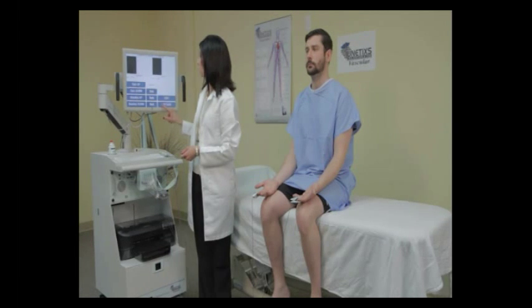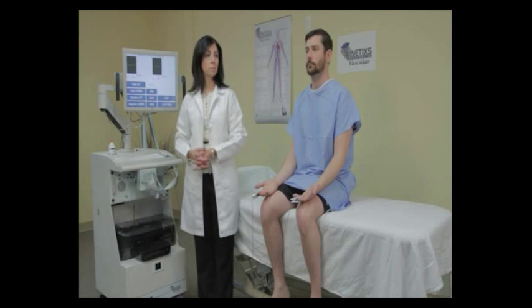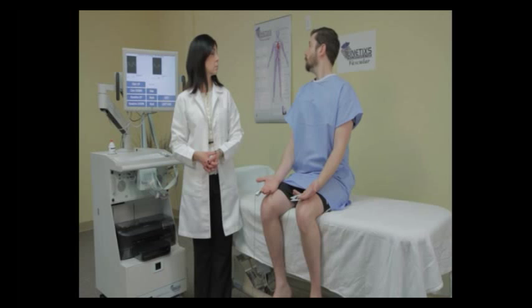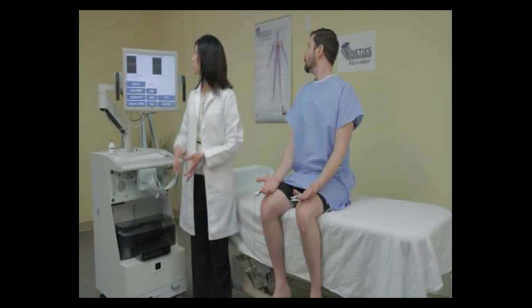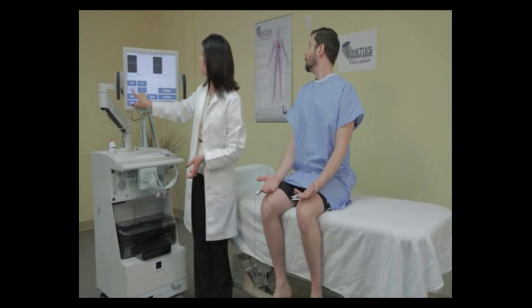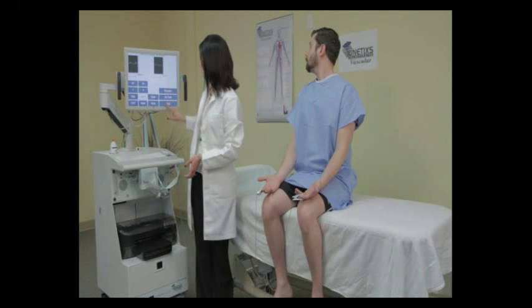The next maneuver is called the Adson's right. Ask the patient to take a deep breath and turn their head as far right as they can while holding their breath. When the on-screen waveforms are consistent, press the capture button. Scroll the waveforms so that you have good visible waveforms on the screen, and press next.